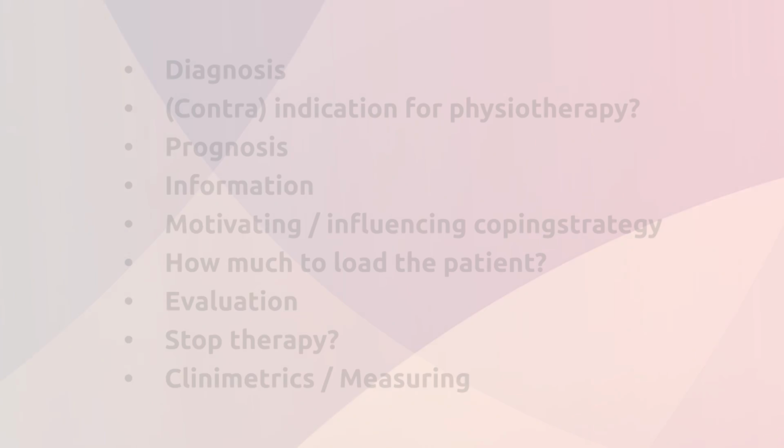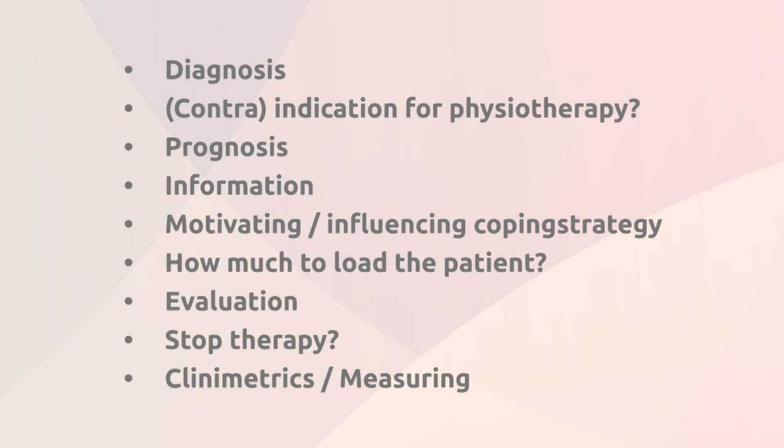Diagnostic MSU in physiotherapy is very common in the Netherlands and several other countries. Some countries, however, have rules that prohibit this. These rules should be followed at all times. Still, MSU in physiotherapy can be used for lots of reasons. I will explain a few of these as an example by using pathology images.